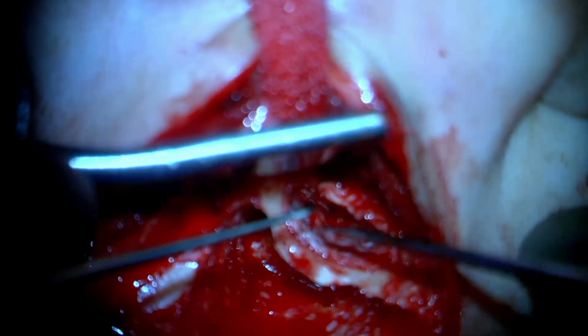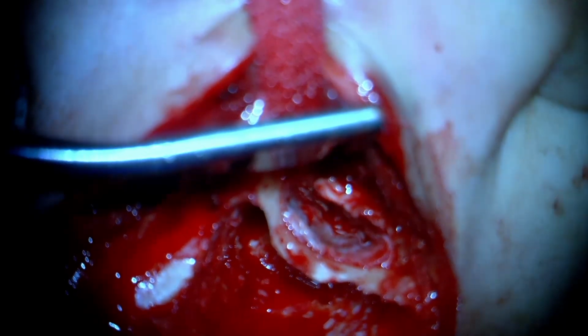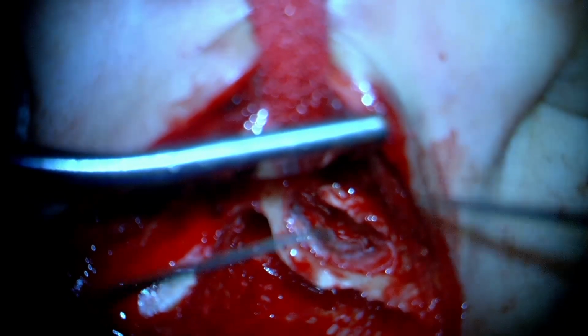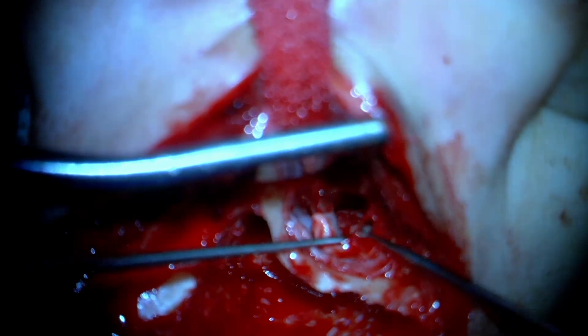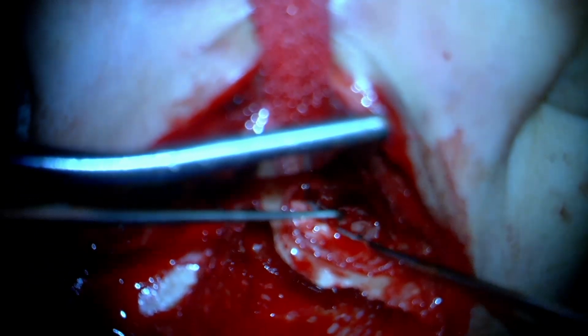It's very important to not leave any bare bone on the canal, because that obviously creates a lot of healing problems. So whenever there is bare bone, one must use fascia to cover the bare bone, over which one can expect slow but steady epithelialization.